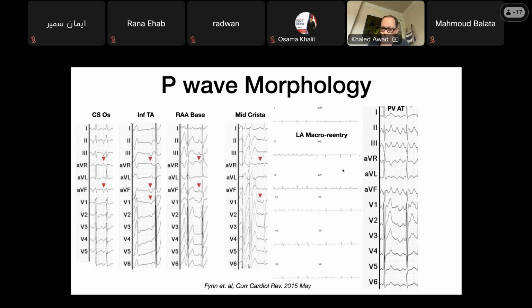And this brings me to a concept I didn't necessarily address very much at the beginning of the talk. What is an atrial tachycardia? What's an atrial flutter? In my mind, those are EKG terms. They were developed early on in the process when all we had was an EKG to try to figure out what those rhythms are. And when there is an isoelectric interval, which you can see here, there's a P wave and a P wave, and between them is an isoelectric segment.